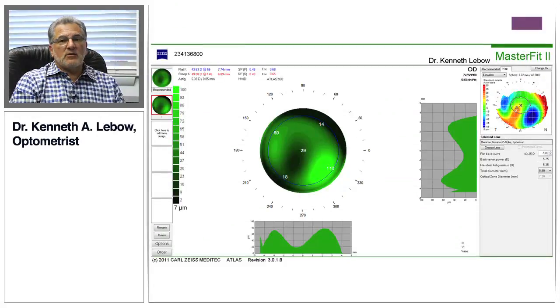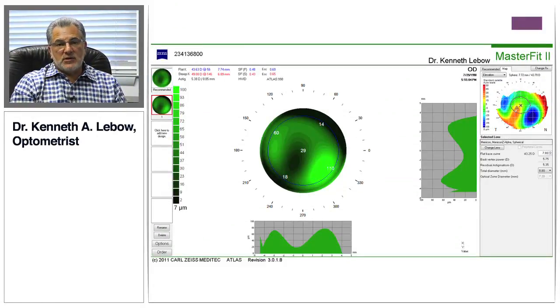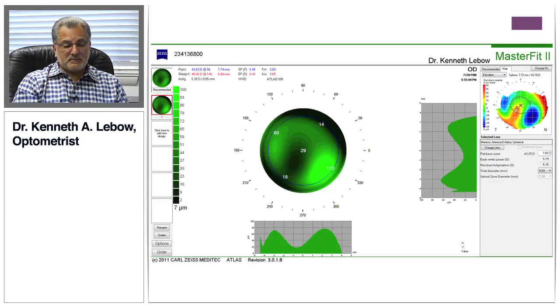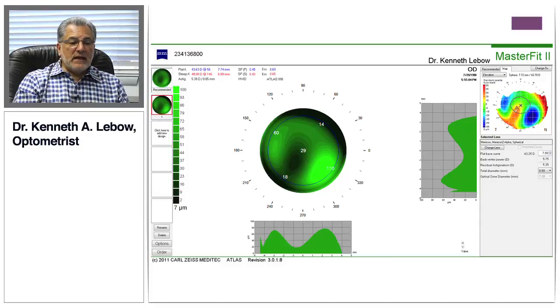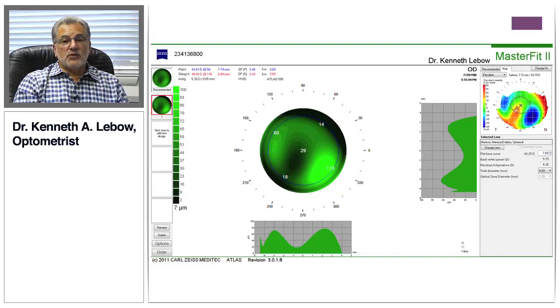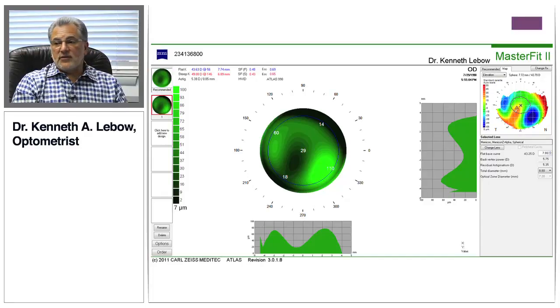The next thing we need to do for this patient, Joe, is recognize that he has developed keratoconus in the years since I've seen him. He's got poor vision, and what we need to do is design a rigid gas permeable contact lens to improve his vision. This is where MasterFit comes in very beautifully.